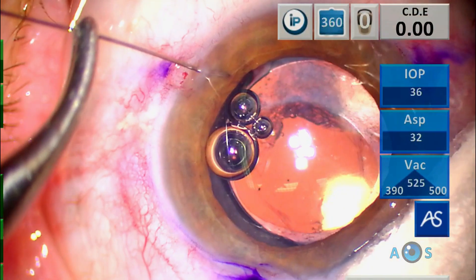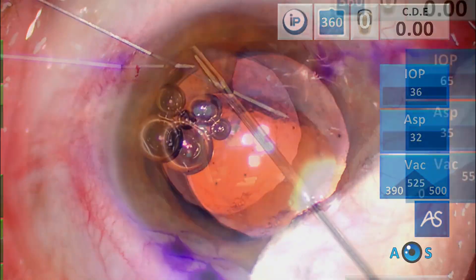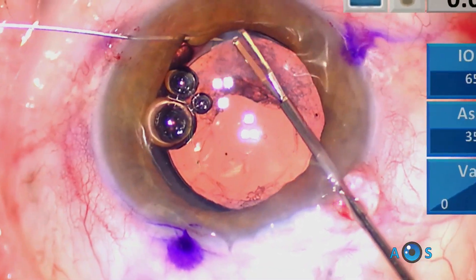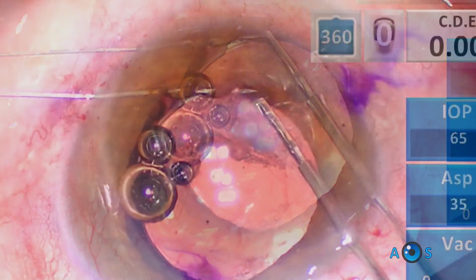The most effective surgical solution is to perform a pupillary cerclage. This is a challenging surgical technique but requires only a double-armed 10-0 prolene suture, a 25-gauge guiding needle, and a 23-gauge micro forceps.